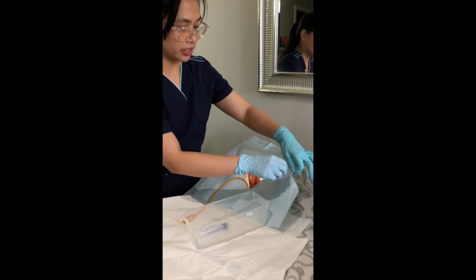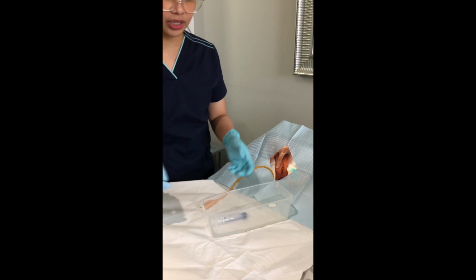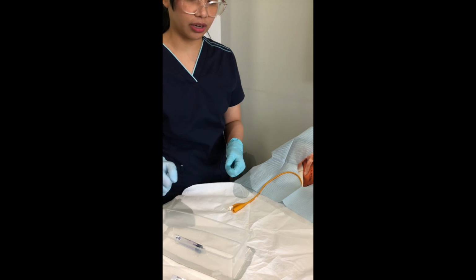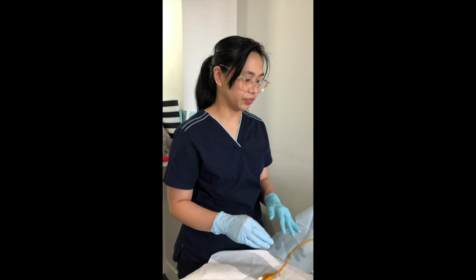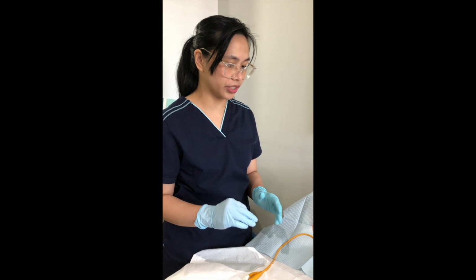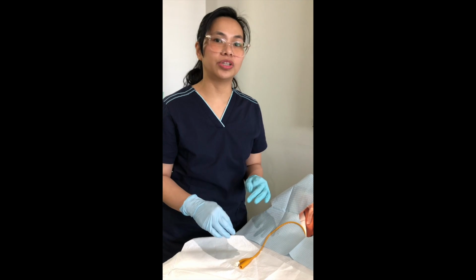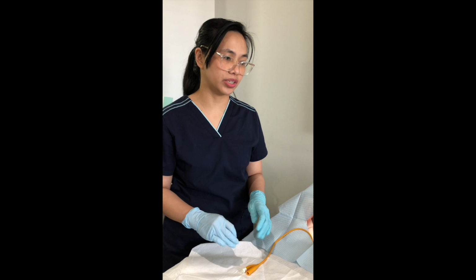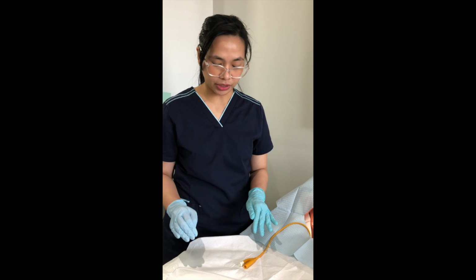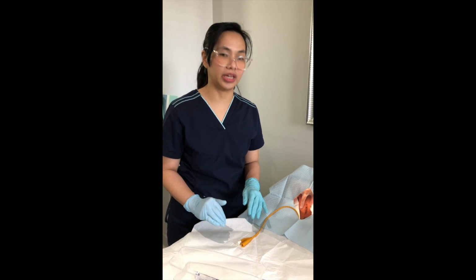Just tear this drape so you can remove it, and then take off your gloves, do hand hygiene again, reassure the patient, check the patient if she's comfortable before you leave, and then do the documentation. Record everything including the size of the catheter and the time that you inserted it. Also, record how much urine has been drained.